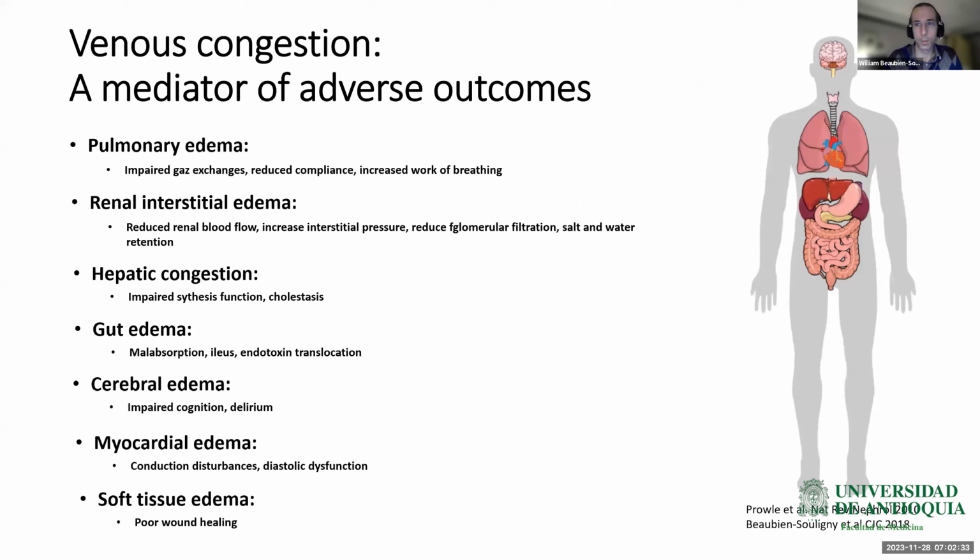In terms of potential preventive interventions, there is pre-op optimization, restrictive fluid strategy when appropriate, inhaled pulmonary vasodilator, or use of inotrope can also be done. And for potential therapeutic intervention, well, negative fluid balance can be done when appropriate. And also repeated ultrasound assessment to help titrate interventions.